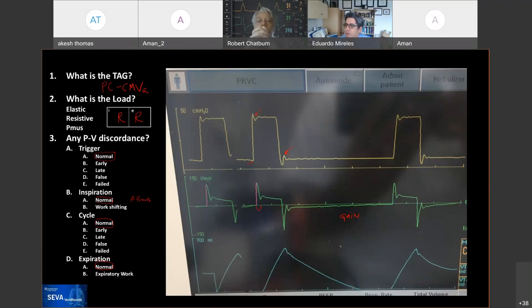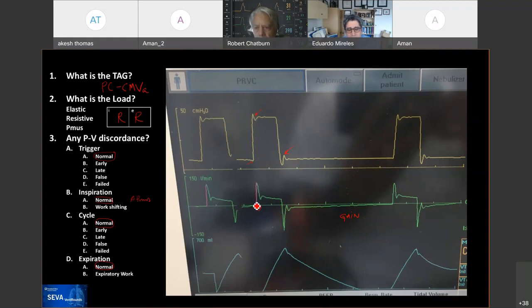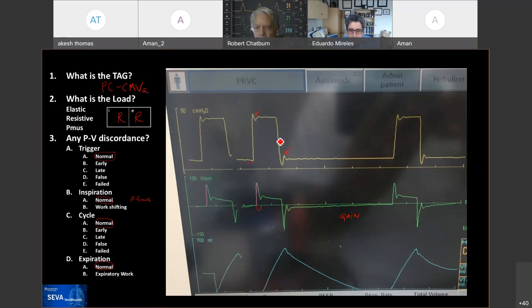From chat: Moja says the rise time is set short, which is why it shoots up. That's right — a classic thing is people getting concerned about these peaks. In general terms, we set the rise time at zero or the minimum possible, because this has no relevance unless the patient was auto-cycling or false-cycling due to reaching a threshold. For these patients, this is completely inconsequential.